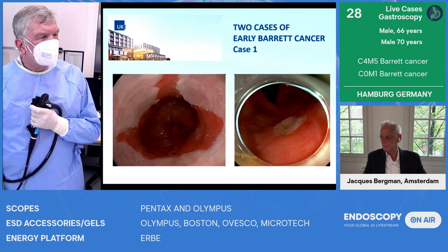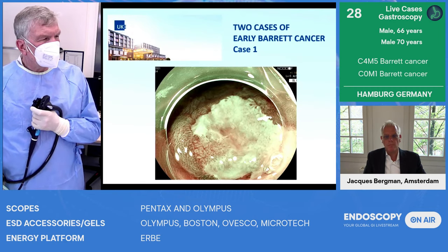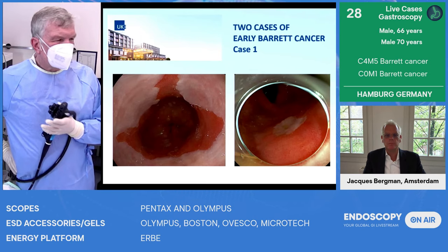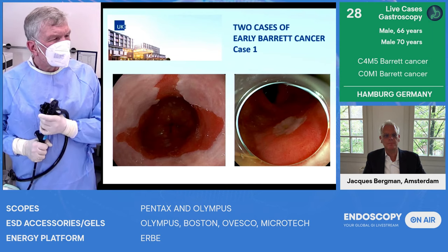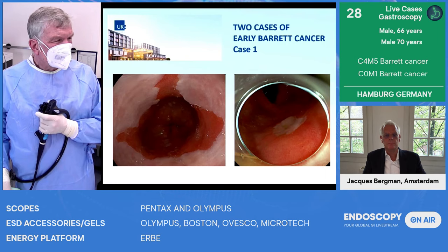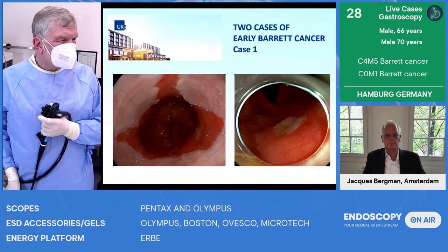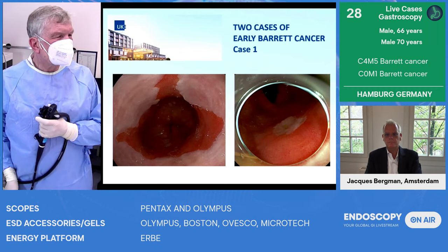The first one, that's Helmut's case, had a resection procedure something like 9 years ago, and then didn't follow up for residual Barrett ablation, which he shouldn't have done, and comes back to his referring physician with an ulcer, and then gets biopsied, and it's high grade, and then he gets PPI. And what you see is that the ulcer has gone, and this looks like a squamous island. It's very tricky. Next slide.